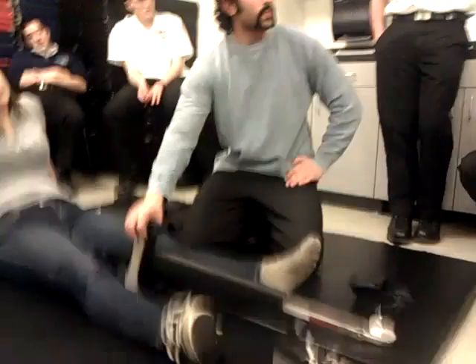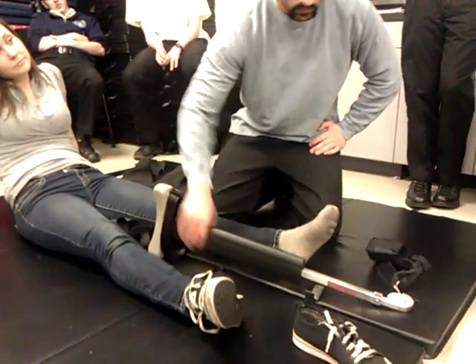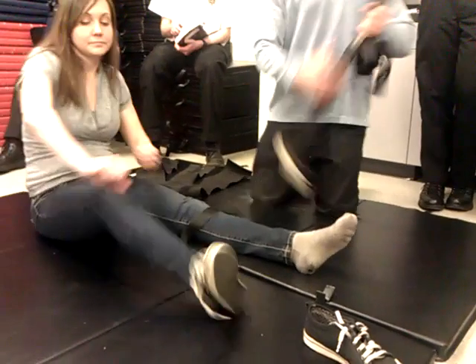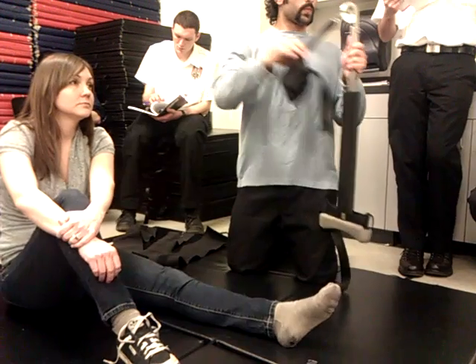Your skill sheet is the same for these 2 stations, which is kind of confusing. So make a note on it that the Sager is what's called a unipolar traction device, and the other one is the bipolar, because it has 2 pulls and not one.